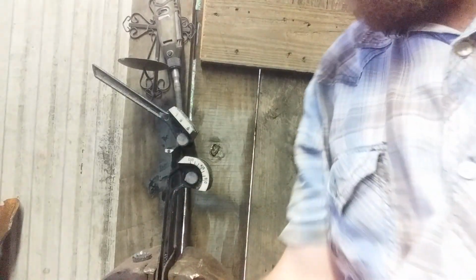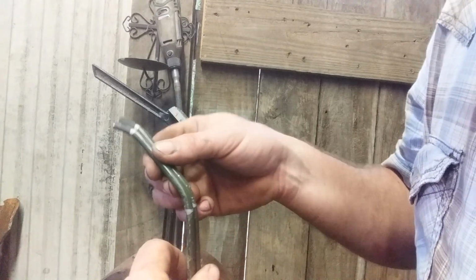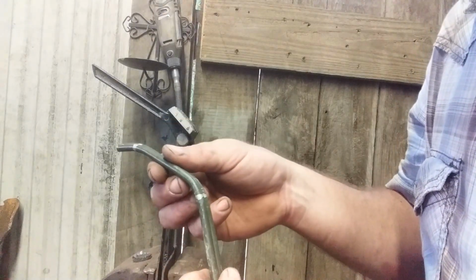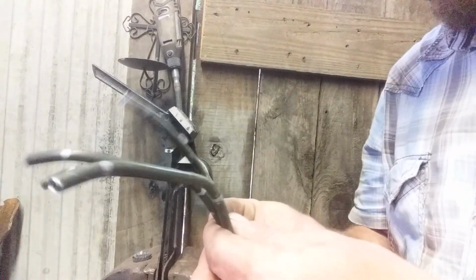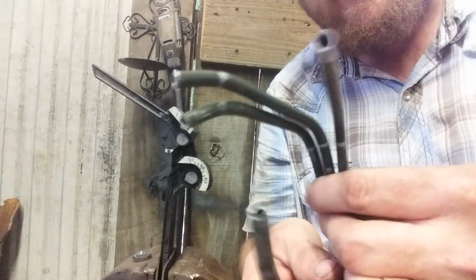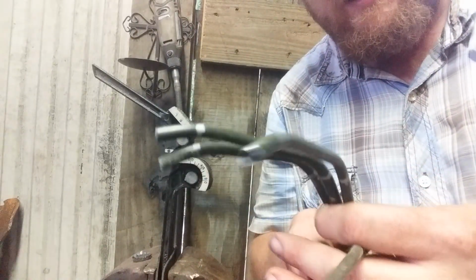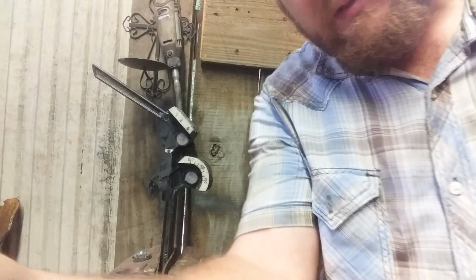That stuff just doesn't move as easy as you think it does. If you've ever worked with automotive brake line, it's pretty mean stuff to work with. Anyway, now we got some fingers. Okay, I'll get on with drilling these holes. See you in a minute.